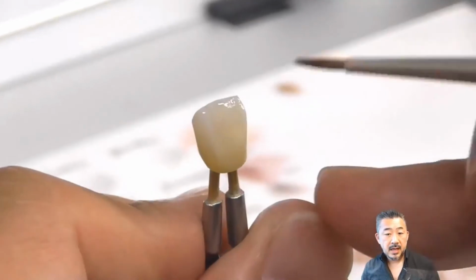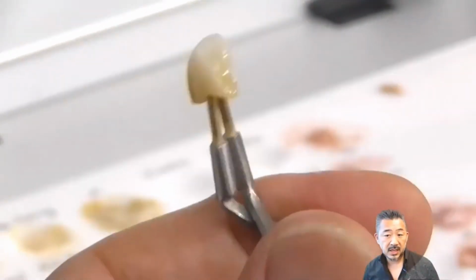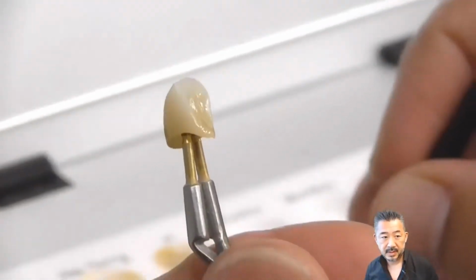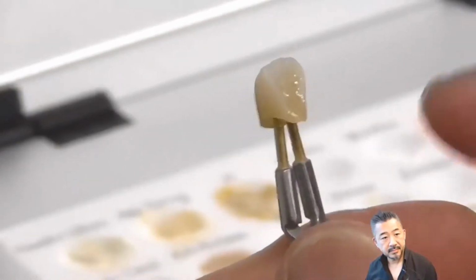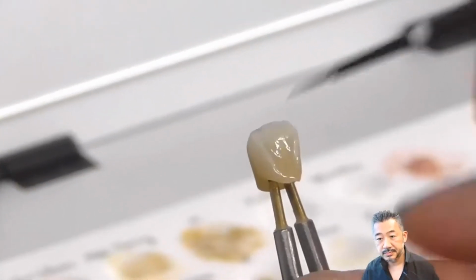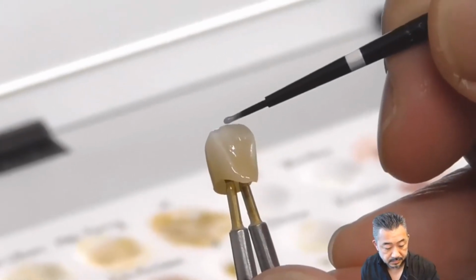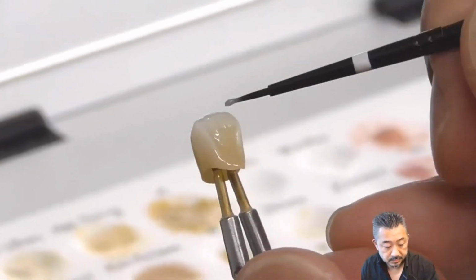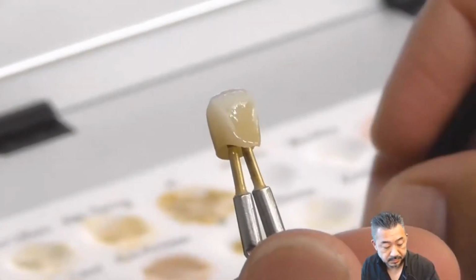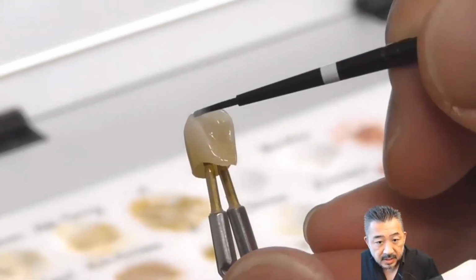In this case, I also apply a little blue paste on the palatal side. So you can see now. Okay, then firing once.